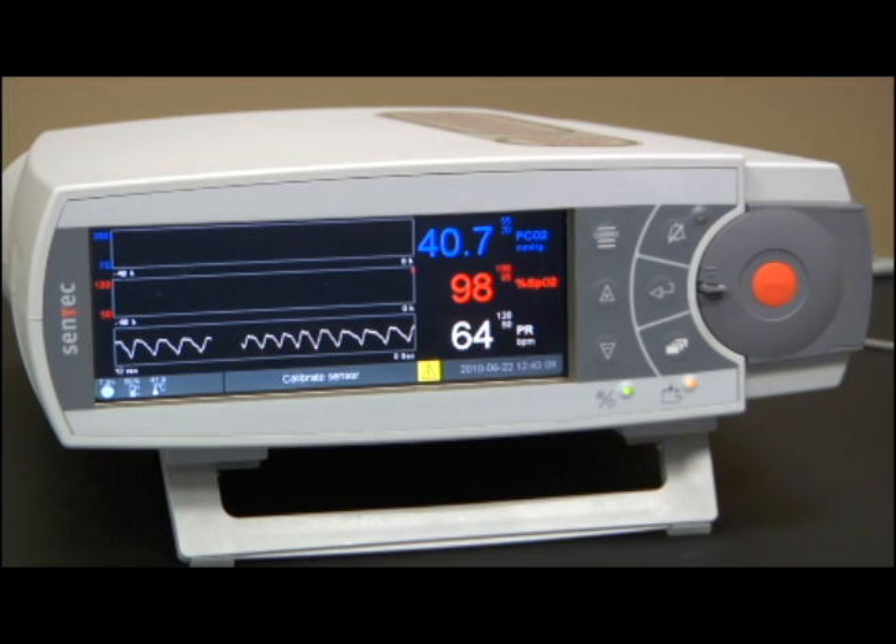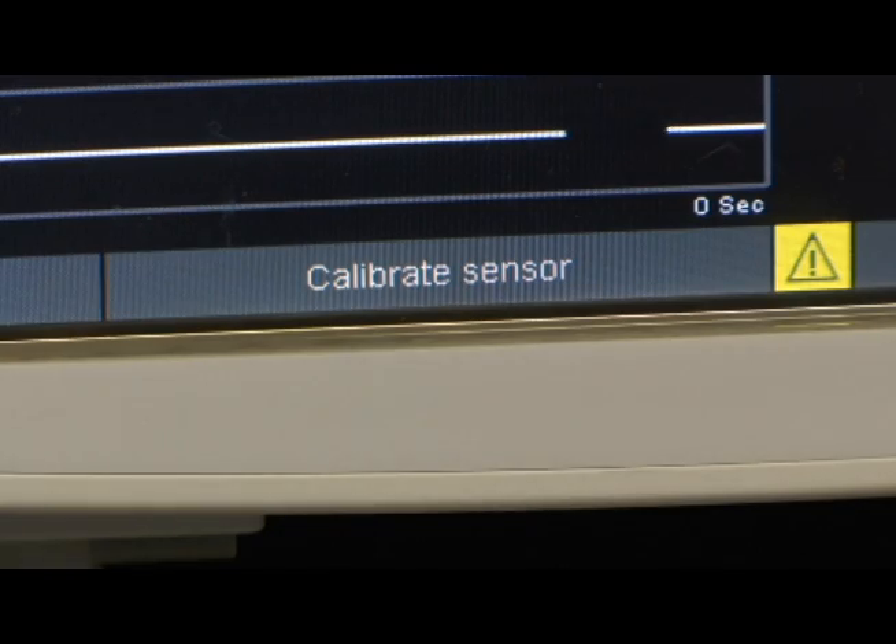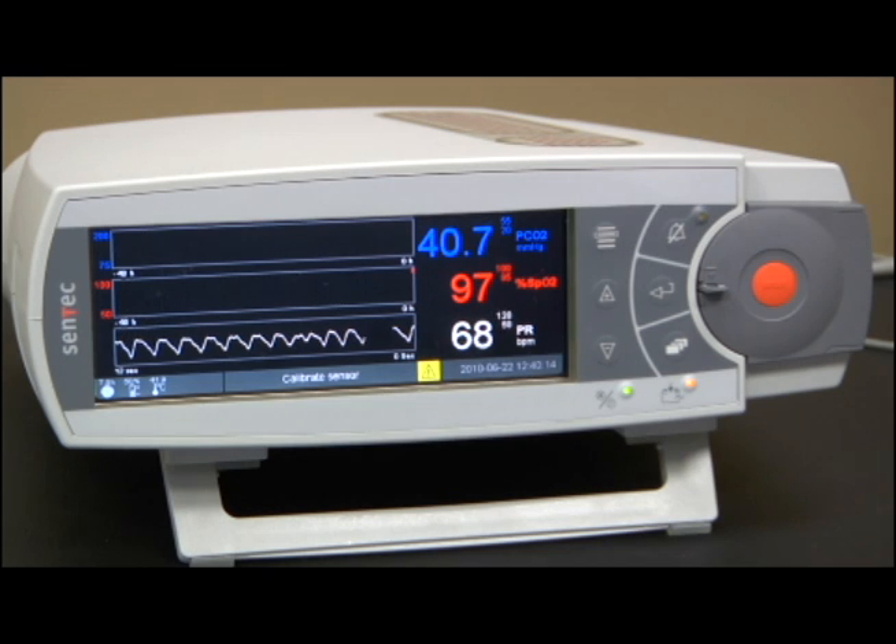Once monitoring time has reached the initial 4-hour interval, the monitor will display "Calibrate Sensor" in the status bar window. As soon as the monitor prompts the message "Calibrate Sensor," remove the sensor from the patient. Depending on which interface you are using, this can be accomplished in the following manner.